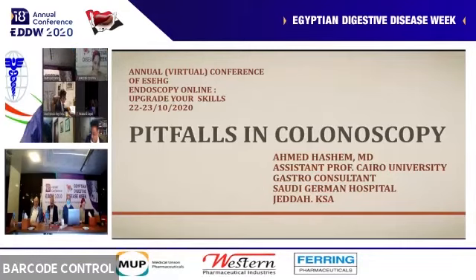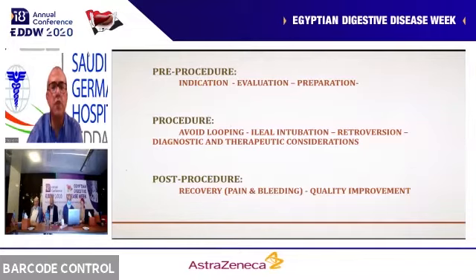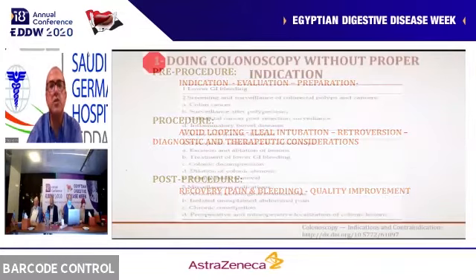To make the story easy, we have pre-procedure, intra-procedure, and post-procedure. Pre-procedure, we'll talk about the indication, evaluation, and preparation. During the procedure, how to do a perfect colonoscopy. And post-procedure, we need to be careful about recovery and quality issues.